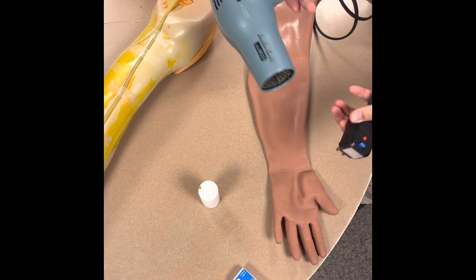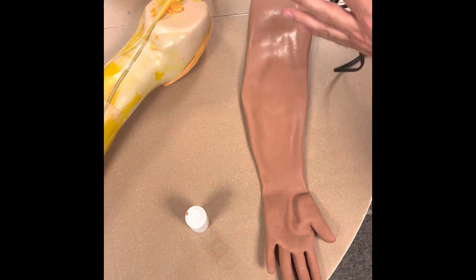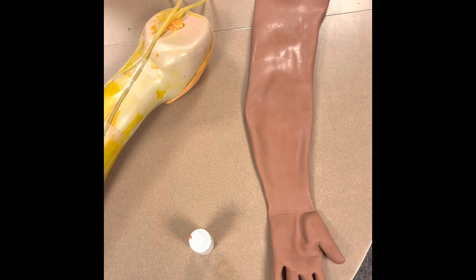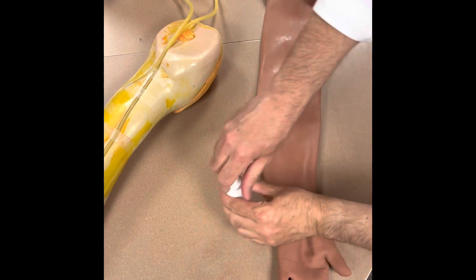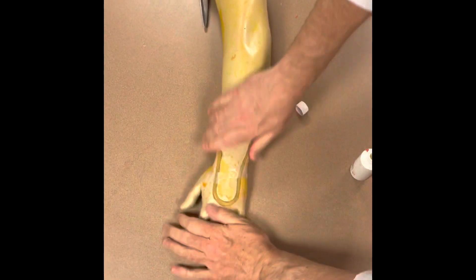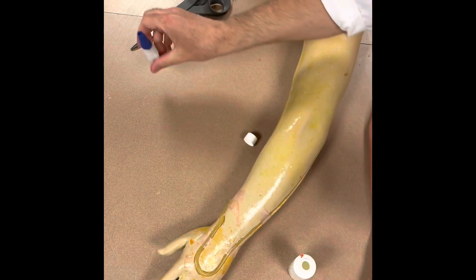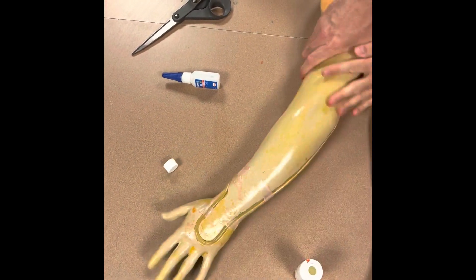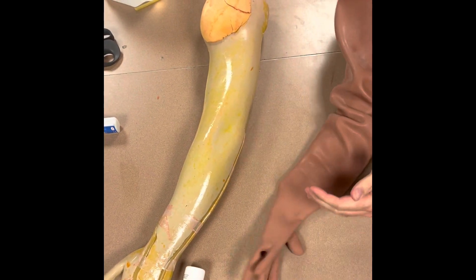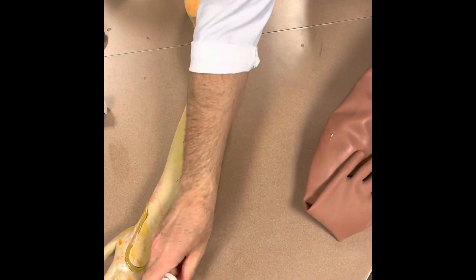I'm going to plug in the hairdryer. Basically, we're going to heat up the arm in this wrist area, and then it'll make it a little bit easier to slide the skin on. Then apply the dish soap inside the arm — use a lot, don't be afraid to use it.